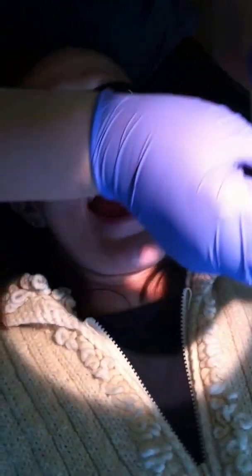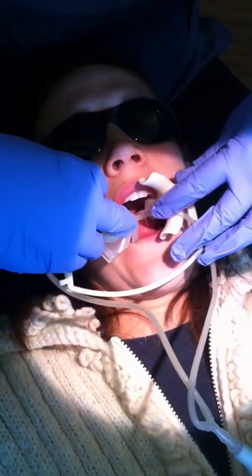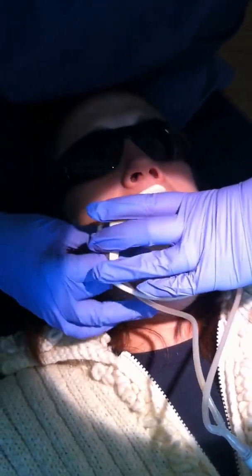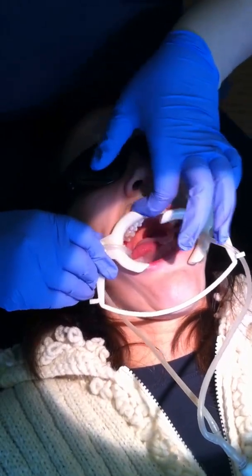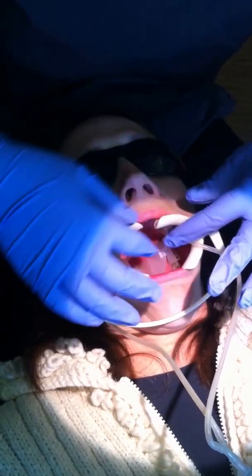Dry field placement involves the use of NOLA, which is a cheek retractor and suction device combined. Amy is placing the NOLA device now. It holds and contains the tongue, as well as has saliva ejection sublingually. We've also used another suction device, the Isolite. Depending on patient preference and size of the oral cavity, an Isolite or NOLA are equivalents.